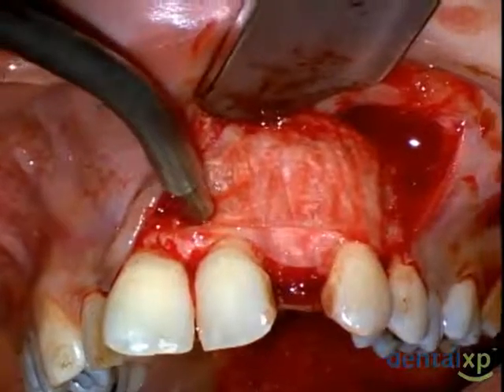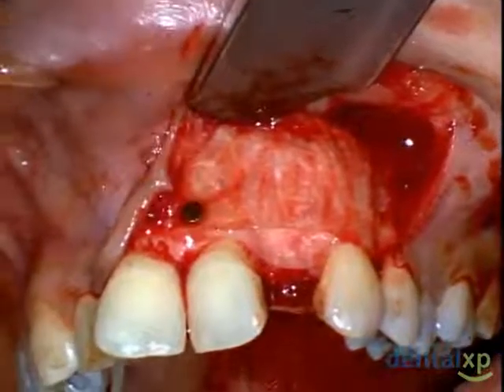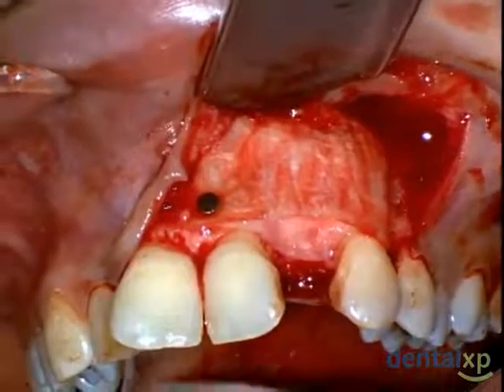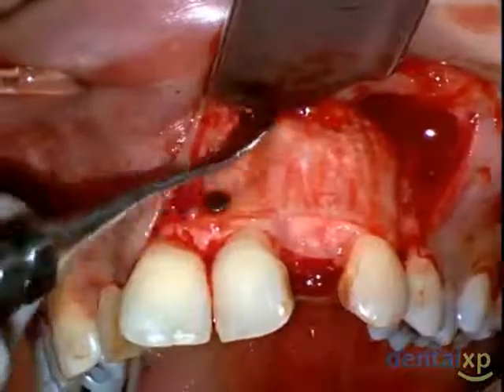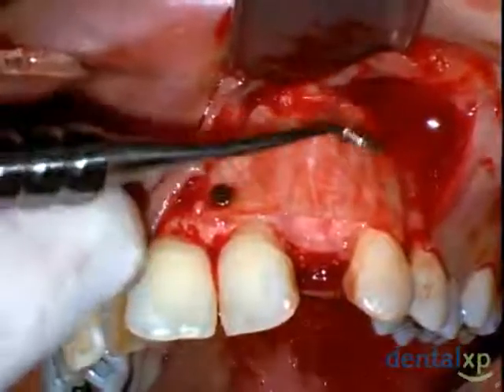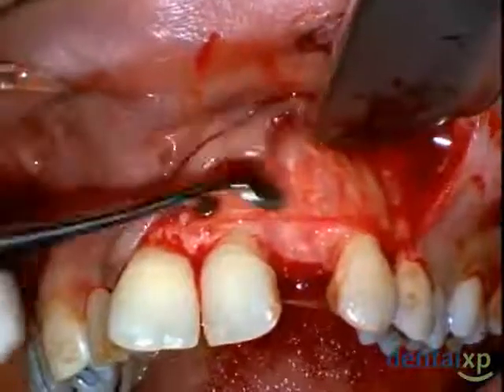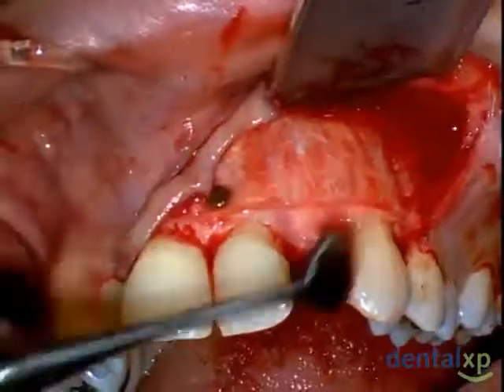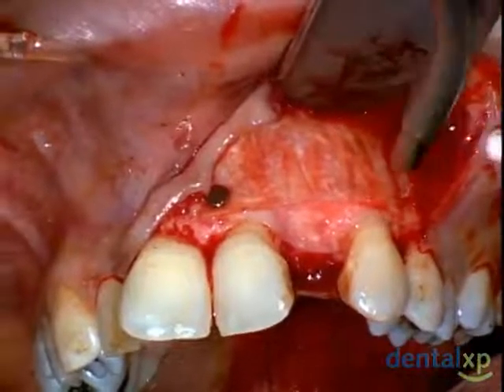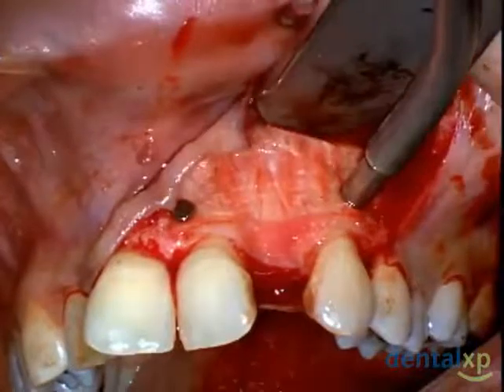This is an excellent way of securing and stabilizing the membrane, which I think is extremely important so that we don't have micro motion or micro movement, which may in fact create a poorer healing of the underlying bone grafted area. So the AutoTac is placed first in between the two central incisors, and then the second AutoTac will be inserted distal to the maxillary left canine, giving us very, very good initial stability of our membrane and long-term membrane function.